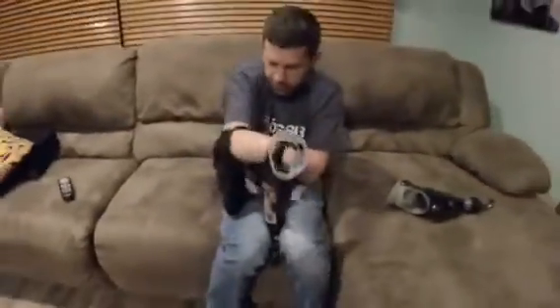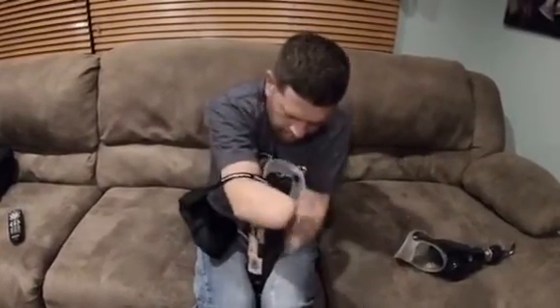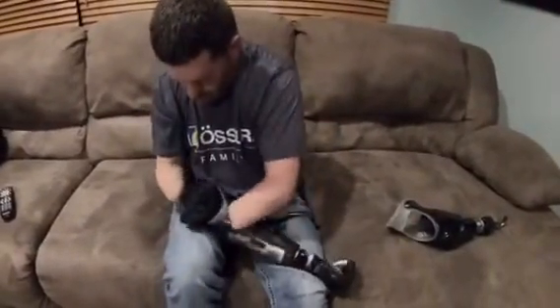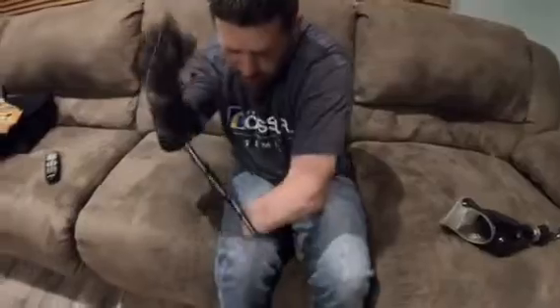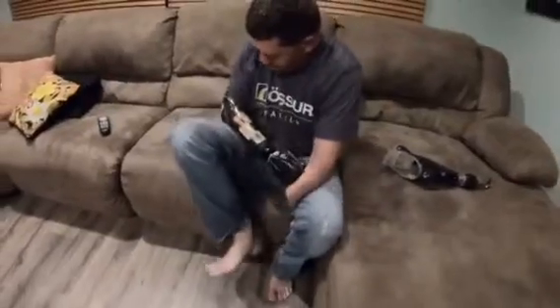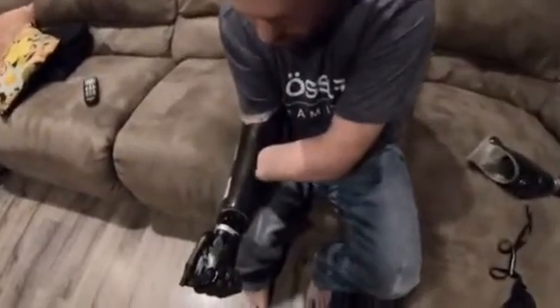To put them on, I always do my right hand first — that's just what I'm used to. I get the strap; this strap right here is basically a nylon, almost like a parachute. I put my residual limb on the inside of it, push in, open it up, stick my foot on it, and just pull it out a little bit at a time. Once it comes out, I can turn it on with my residual limb.